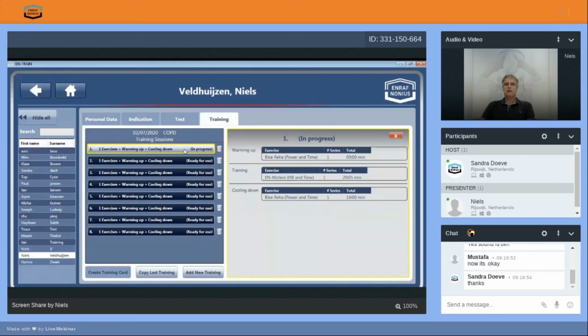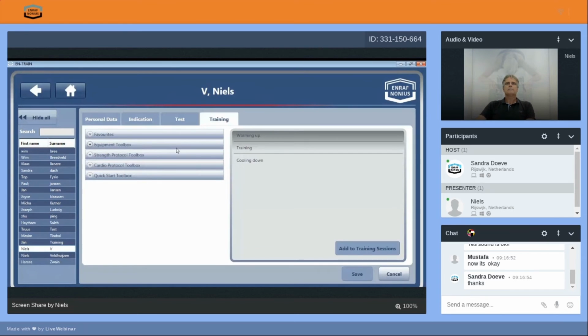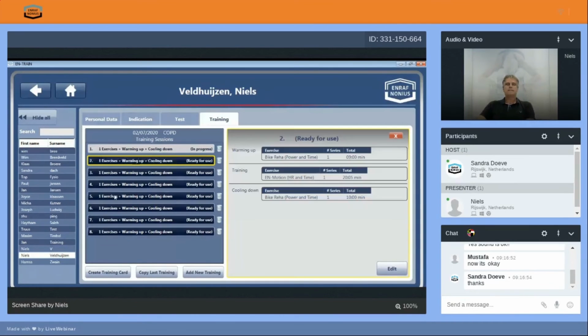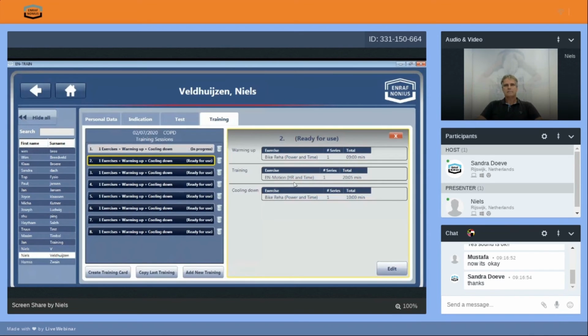Next time Niels is coming, the only thing you have to do, for example, you're busy with other people. Niels is coming into the clinic. You click on Niels. Click on the second training. Create training card. Put the card in. And Niels is ready for the second training.